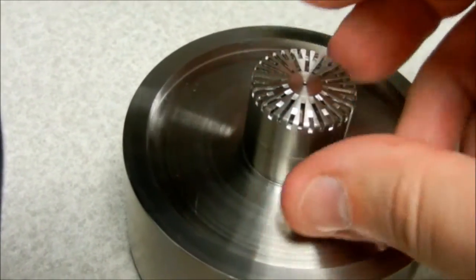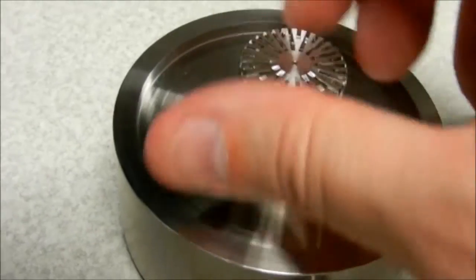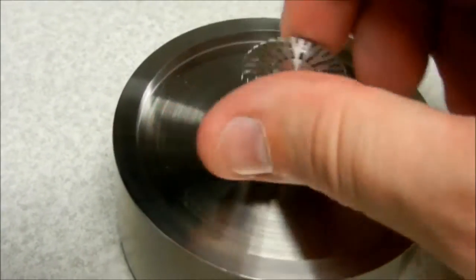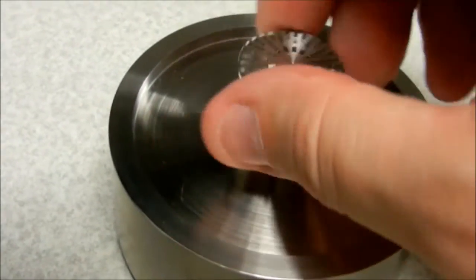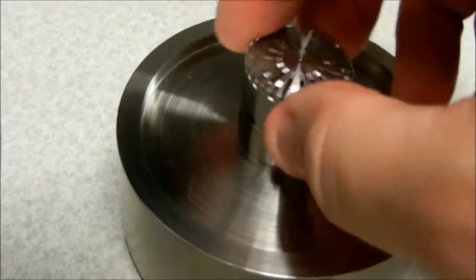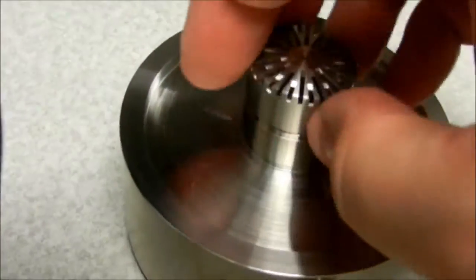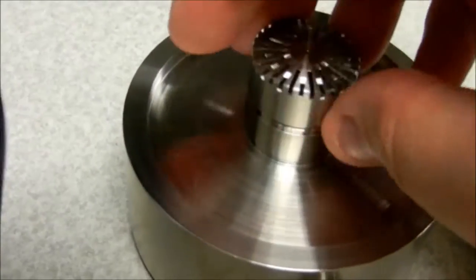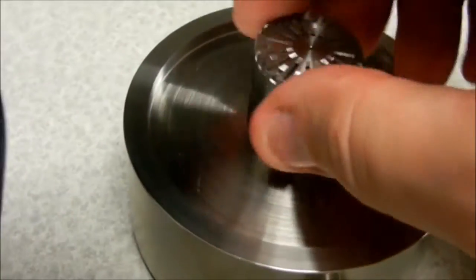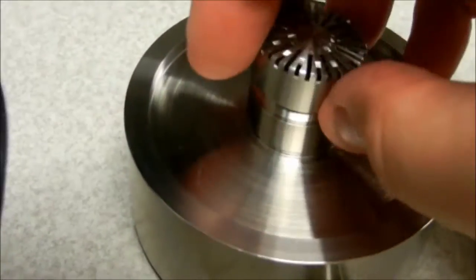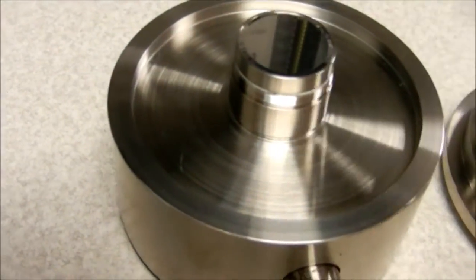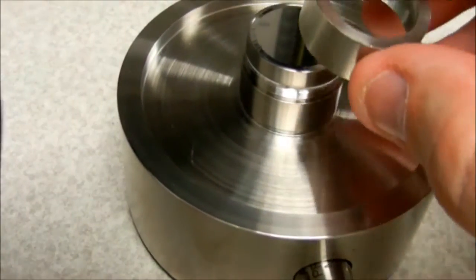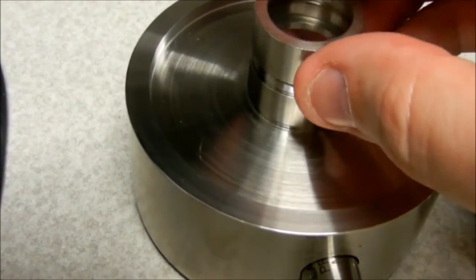And then this little cap here screws off. This is the actual microphone transducer you're about to see, right there, and we replace this on top gently.